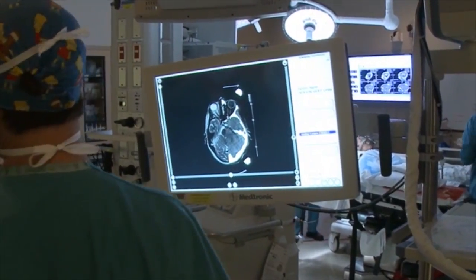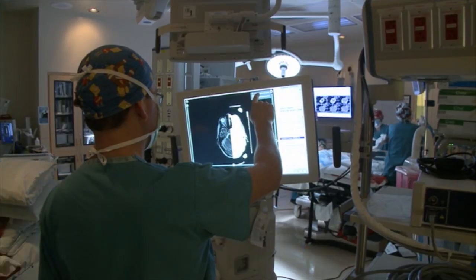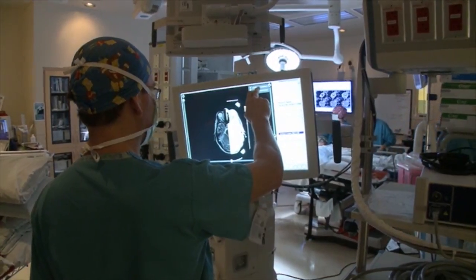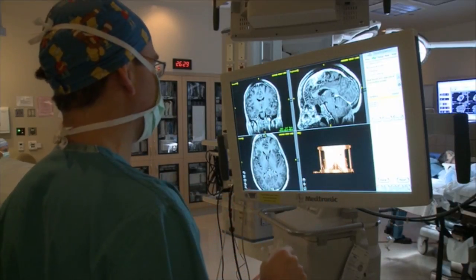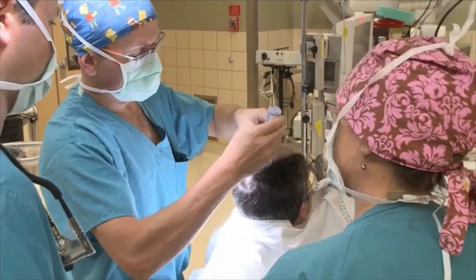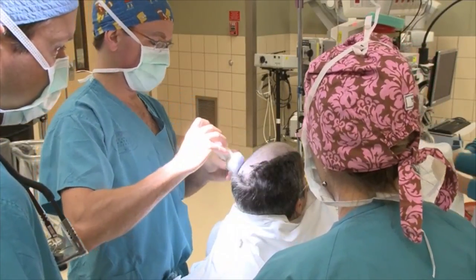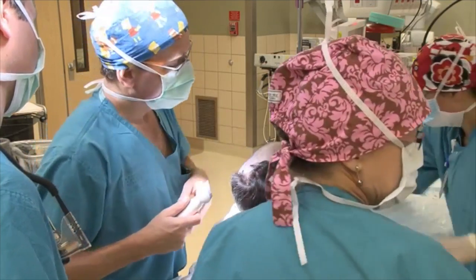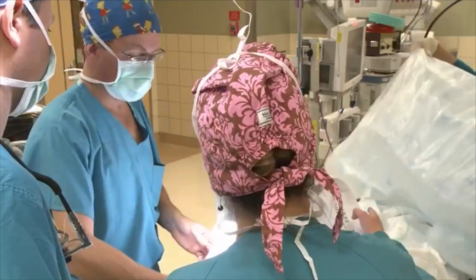As Dr. Gwynn is doing his targeting — a process that takes about 15 minutes — we're transferring the patient onto the operating room table after placing a catheter. For many patients, one of the hardest parts to get your head around is the idea of shaving all your hair or getting a very short haircut. In general, it's best to just get a nice short haircut all the way over, and after surgery it will grow back.